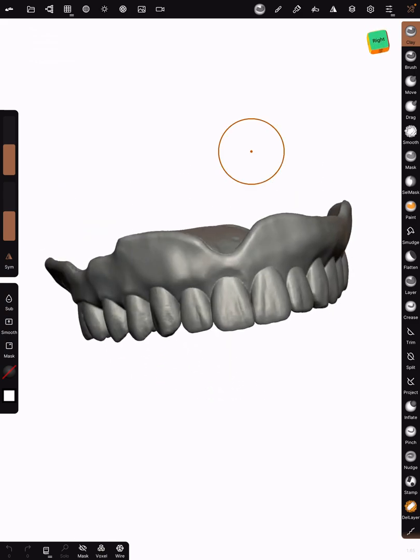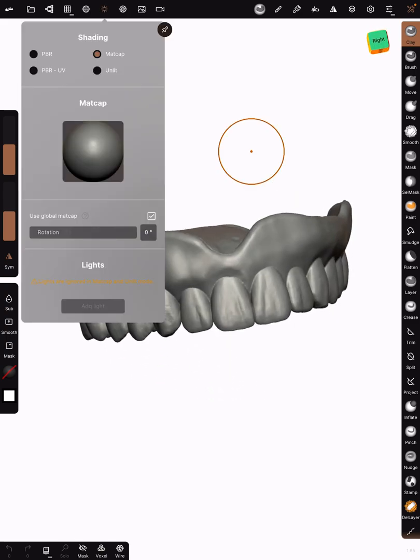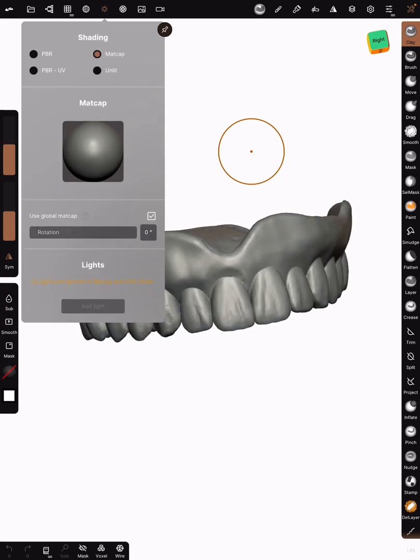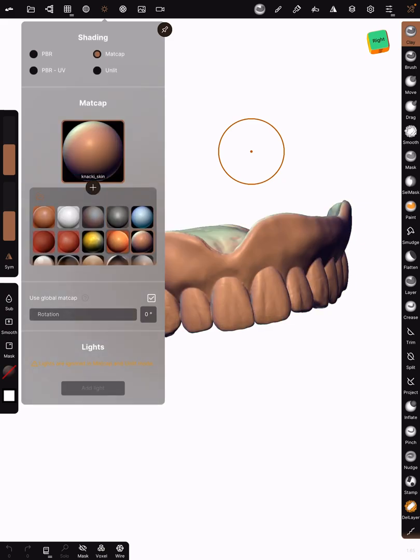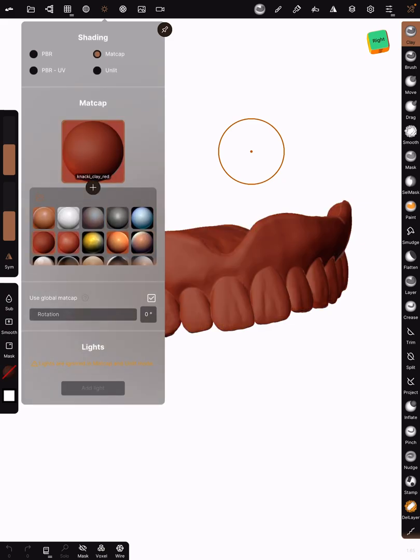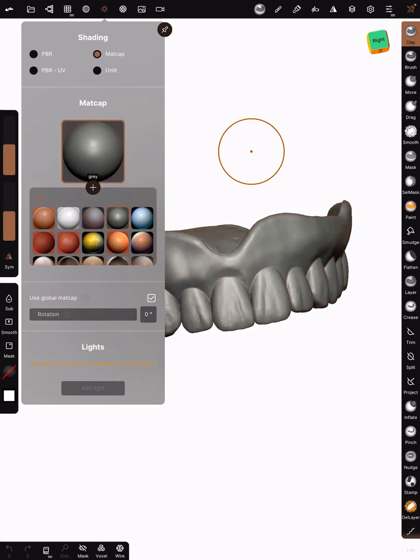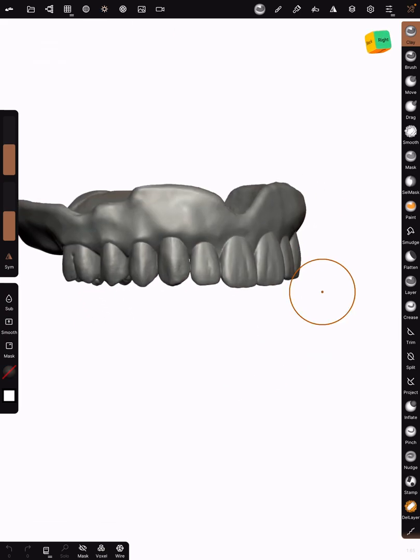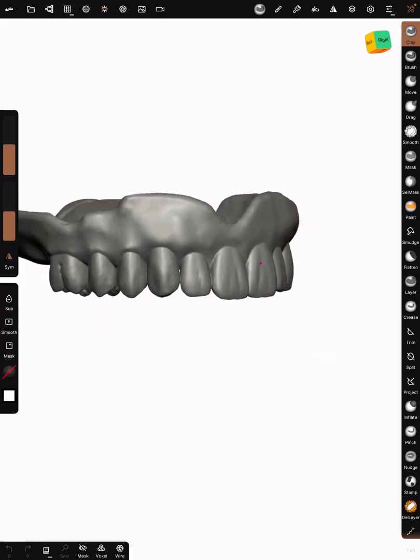The first thing that I did that's a little bit different from your initial default setup is I went to this little sun icon right here and I changed from PBR to Metcap, and I changed my material to gray because I just like the way that I could see texture on gray better.